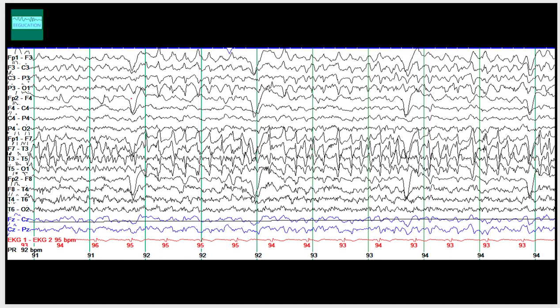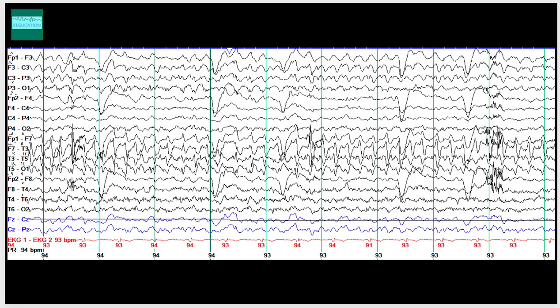You're starting to see some eye blinks along with the seizure. Previously there were no obvious eye blinks, but here you can see eye blinks in association with the seizure. You can suspect just looking at the EEG that the patient is now awake, since you started seeing eye blink artifacts. The heart rate on this page varies from 93 to 96 beats per minute, which we will mention in the final report. The frequencies have slowed down, there is still a mixture of frequencies, eye blinks are still obvious, and the right hemisphere is not showing any rhythmic activity but does show slow activity.